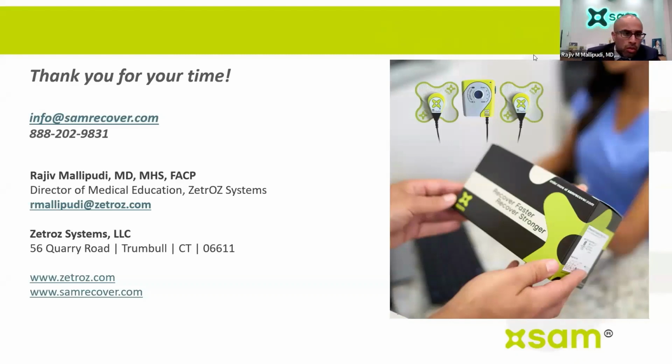Going back to an earlier question, I think was from Cindy. Yes, you can use it if someone is on antithrombotics or anticoagulation, that's fine to use. As far as specific contraindications, we do not recommend it being used on any site of solid malignancies. For example, if you have breast cancer and you have a really sore part of your pectoral muscle, do not place it on there. If you have kidney cancer and it's affecting your back, we wouldn't recommend applying the SAM directly over that area. If you have an elbow injury and you have stage 1 kidney cancer, yes, you can use it on your elbow. I mean, it's a long way from there.